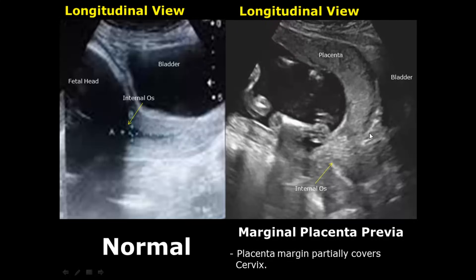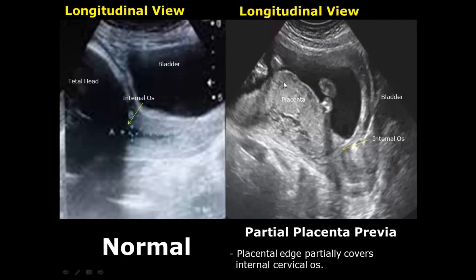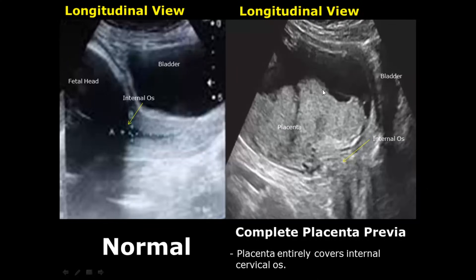When the placenta overlies the cervix it is known as placenta previa. The first type is marginal placenta previa, in which the placental edge or placental margin will overlie the cervix but will not cover the internal os. In partial placenta previa, the placenta will partially cover the internal os — here only the inferior part is covering the internal os. In complete placenta previa, the placenta will completely overlie the internal os, as you can see here.